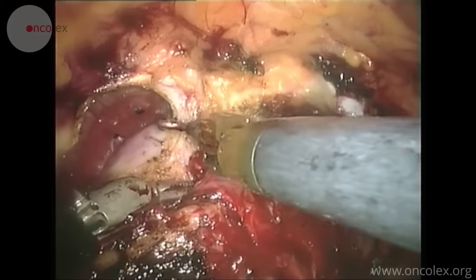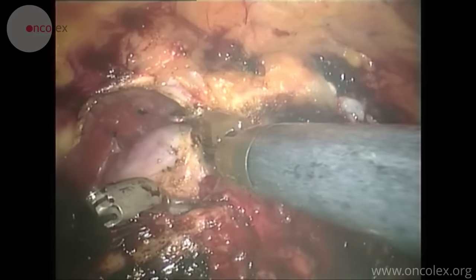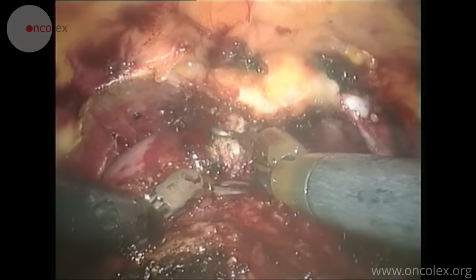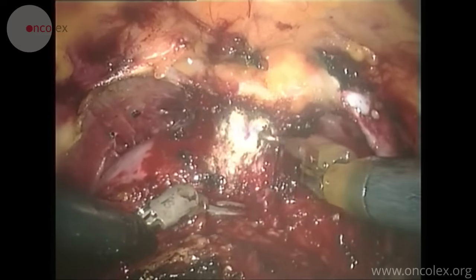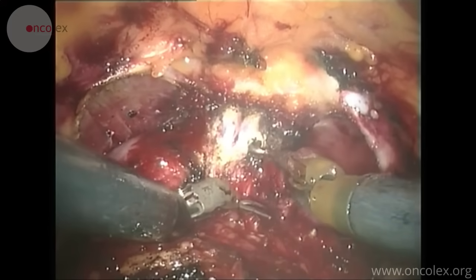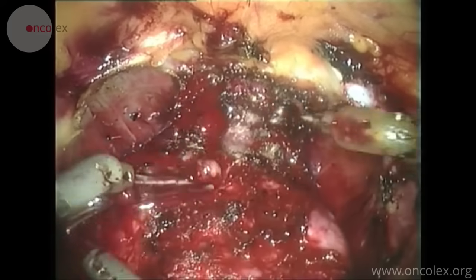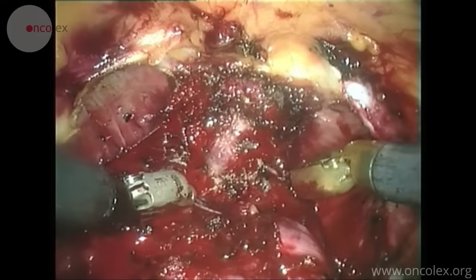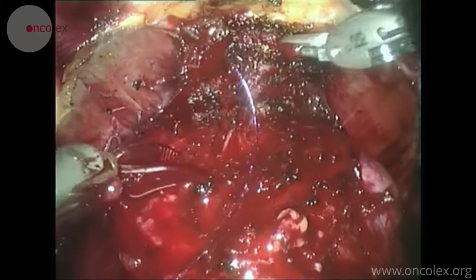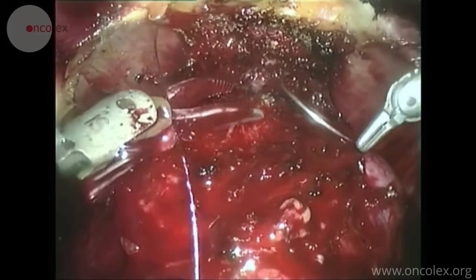Due to the pressure in the abdominal cavity, there's minimal bleeding. After cutting the venous plexus down to the anterior urethral wall, a hemostatic cross suture is placed in the venous plexus.